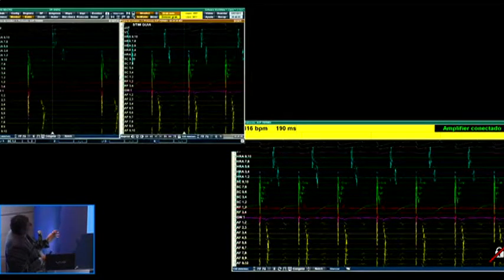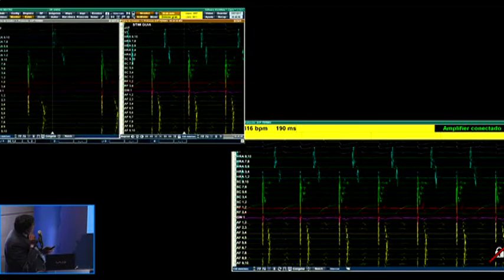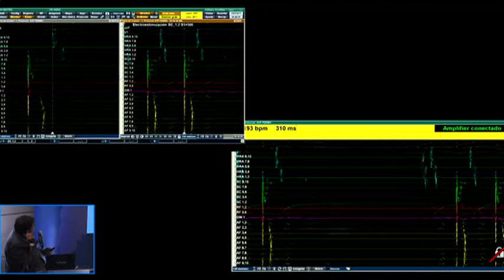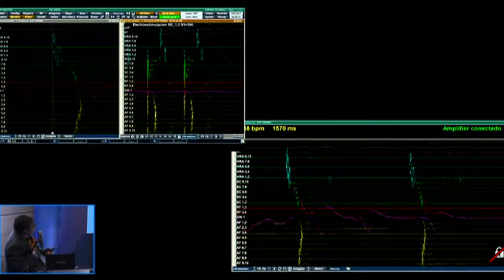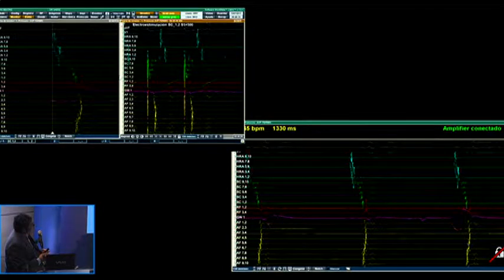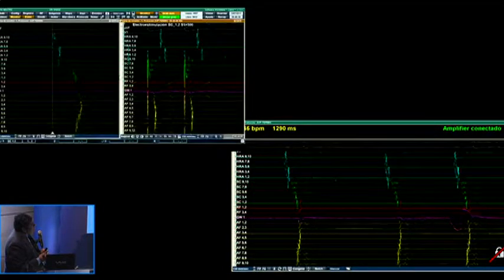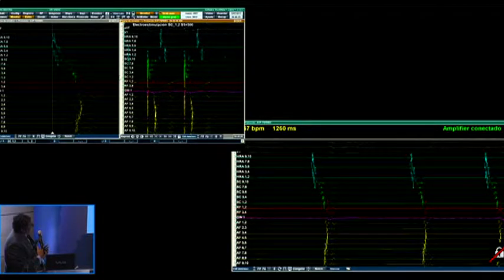Yo creo que deberíamos poner alcohol durante pacing. Administer alcohol during pacing in the appendage to see how it reverts. I am not pushing the limits, but this may happen sometimes. So let's begin. Alcohol injection, would you agree?